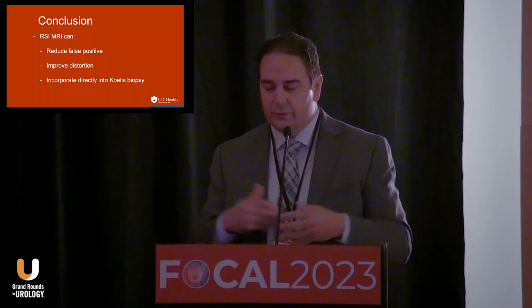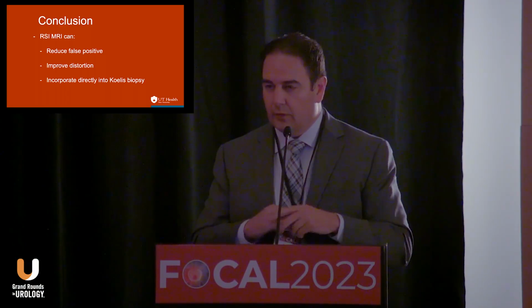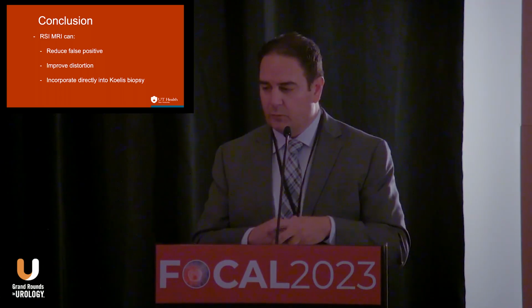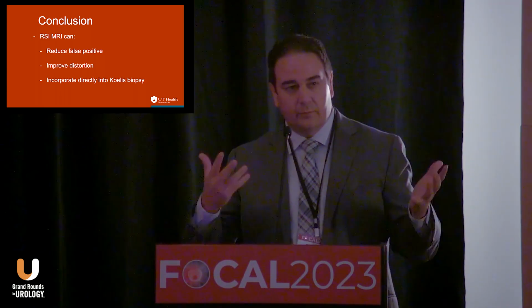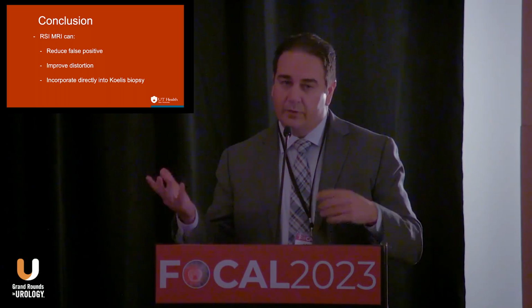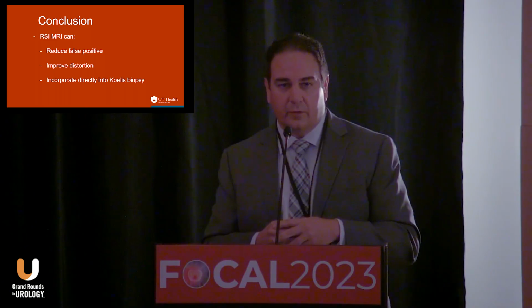So in conclusion, I think RSI is a very novel product, and it could help with some of the things that we talked about this morning: reduce false positive rates, improve distortion corrections, and be incorporated into, we did it with Koelis already, but I see it being incorporated into many other technologies.